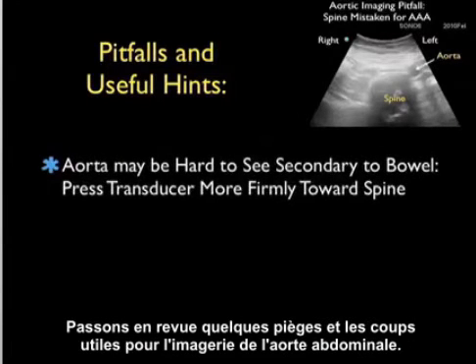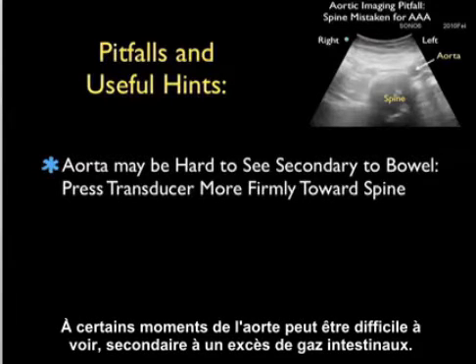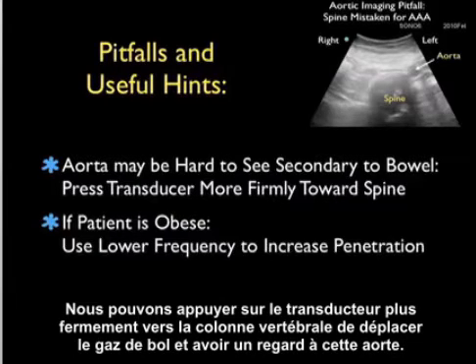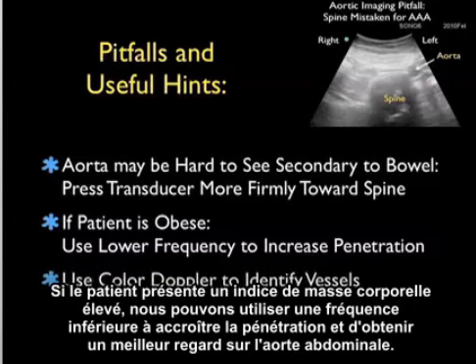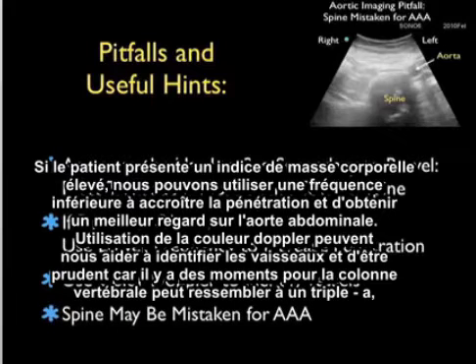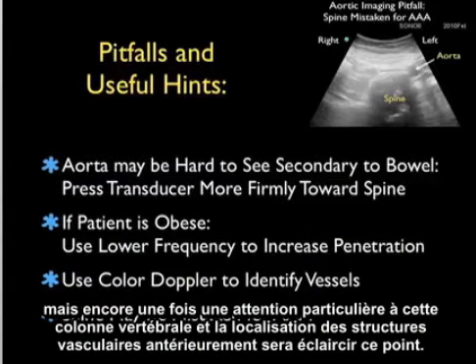Let's go over some pitfalls and useful hints for imaging of the abdominal aorta. At times the aorta may be difficult to see secondary to excess bowel gas; we may press the transducer more firmly towards the spine to displace the bowel gas. If the patient has a high body mass index, we can use a lower frequency to increase penetration. Using color Doppler can help us to identify vessels, and be careful because there are times where the spine may look like a AAA. Close attention to the spine and the location of vascular structures anteriorly will clear that up.